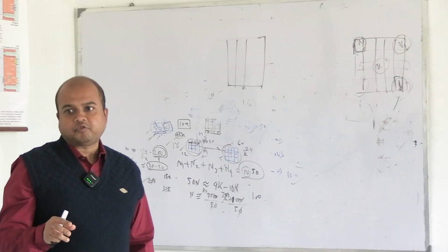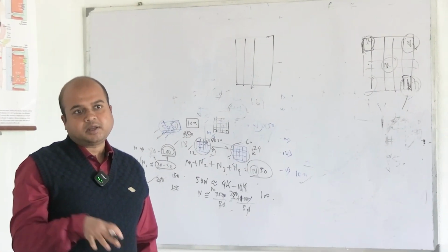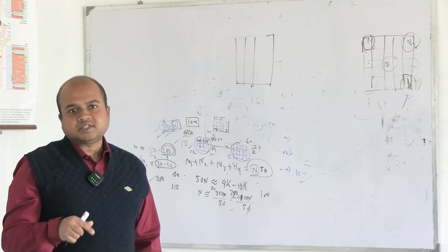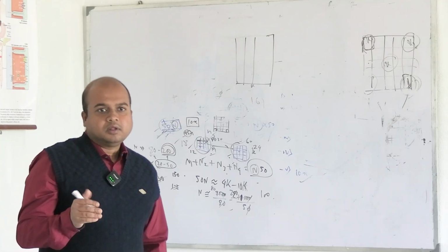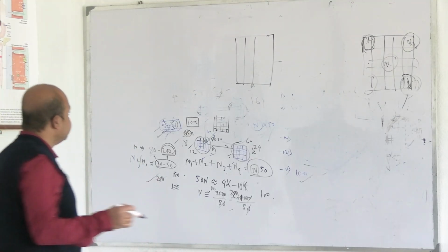This is somewhat different from WBC in terms of the calculation part and also the counting of the cells, because the squares are more in number, in the sense that there are more divisions.